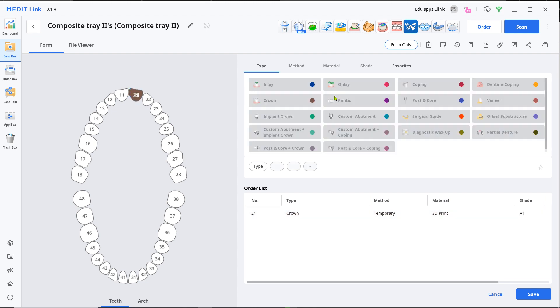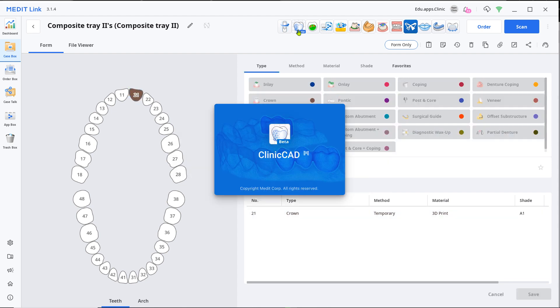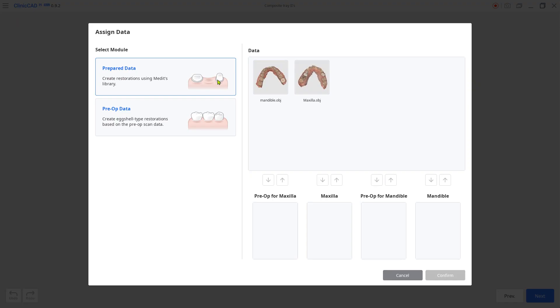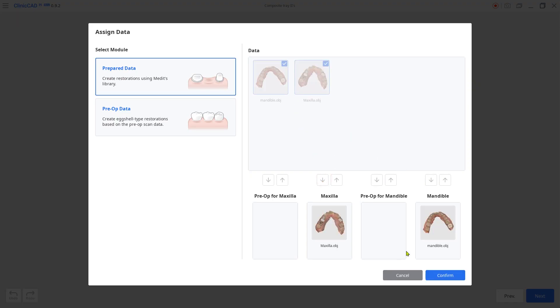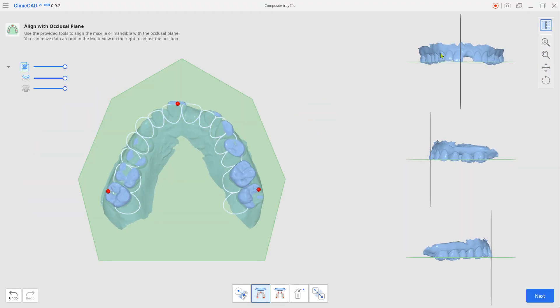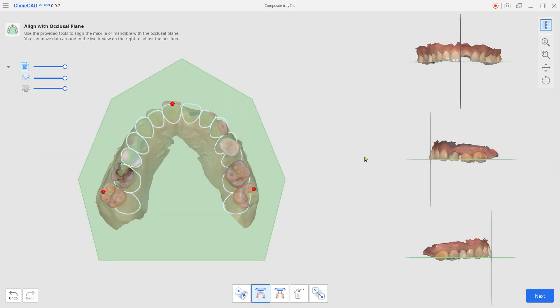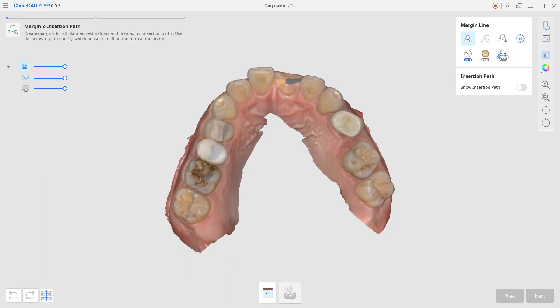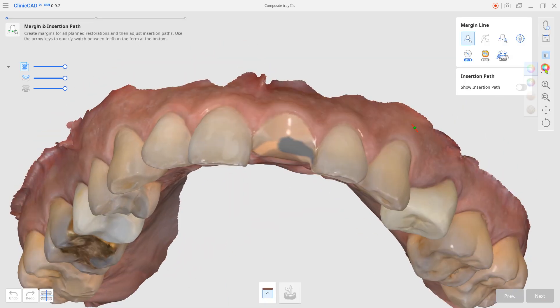Load your files from the ClinicCAD app. Select the prepared mode. Set the margin and insertion path.